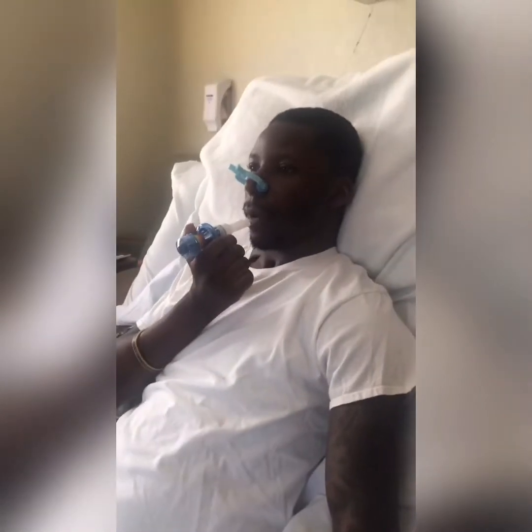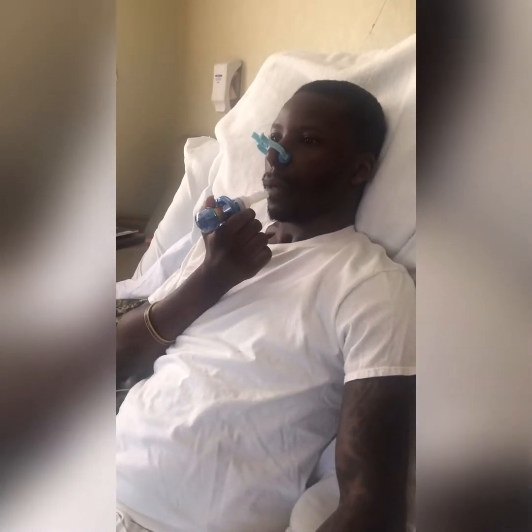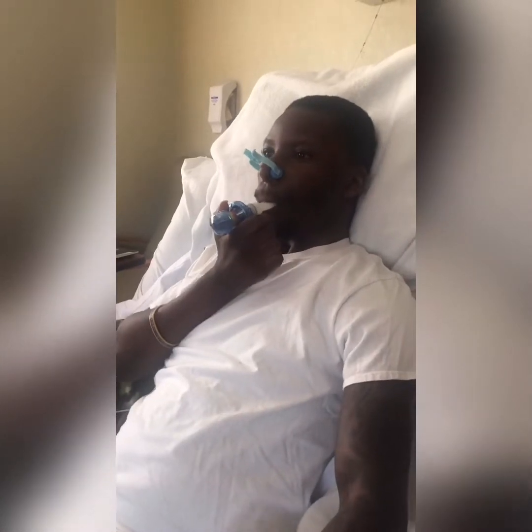Today in physical therapy, we're starting to work on improving John's ability to breathe and get a really deep breath, which will hopefully help him cough better. So, what I've done is put the nose clips on. He takes the deepest breath that he possibly can and exhales as hard as possible through this little device.